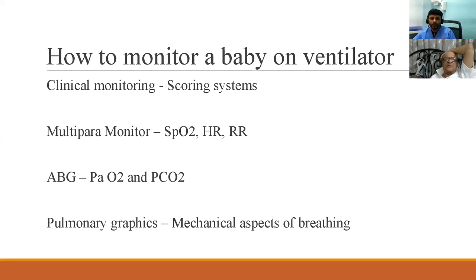ABG, we all know, we do it on a regular basis to check the pH, PaO2, PCO2, and of course any metabolic acidosis in terms of bicarb and base excess. But excluding all this, my current topic today is pulmonary graphics, where we look at the mechanical aspects of breathing. So this is looking at every breath of a baby. In a sense, with every breath the baby takes, we keep looking at how it's changing in terms of the baby's own pathology change, as well as the response to whatever we have done for the baby.